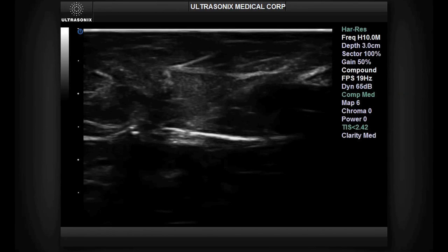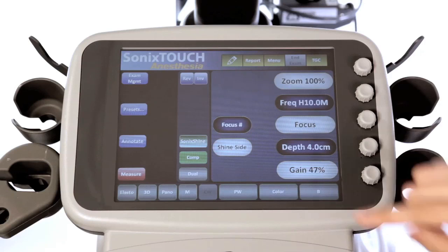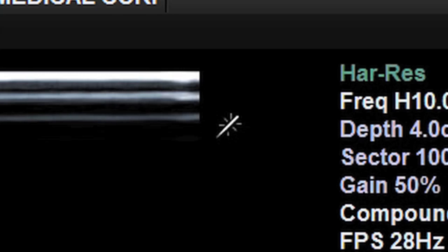To enhance your needle in the tissue, touch the SonicShine button on the panel of the Ultrasonics system. When the SonicShine Needle Enhancement Technology is activated, a button that says Shine Side will appear on the touch screen. This button will prompt you to select whether your needle will approach from the right or left side.